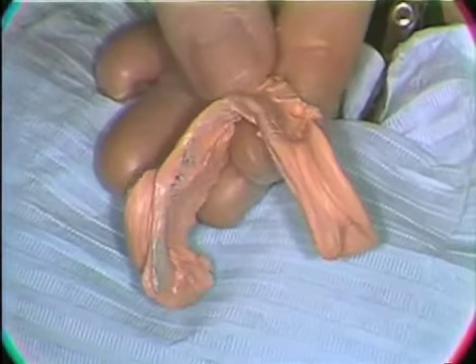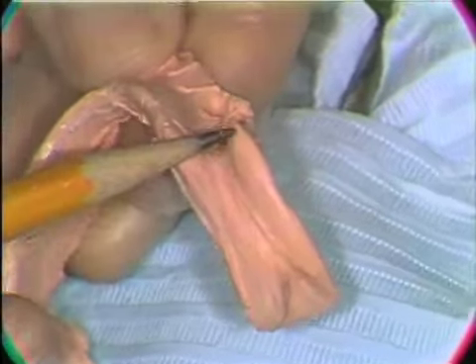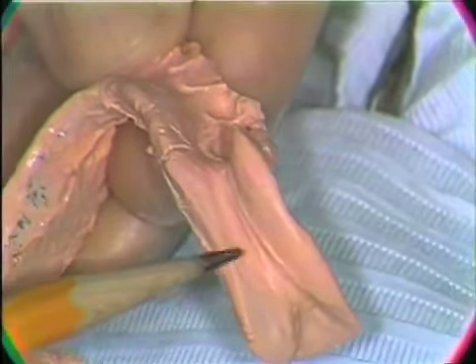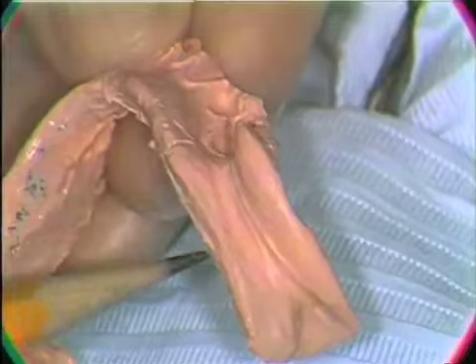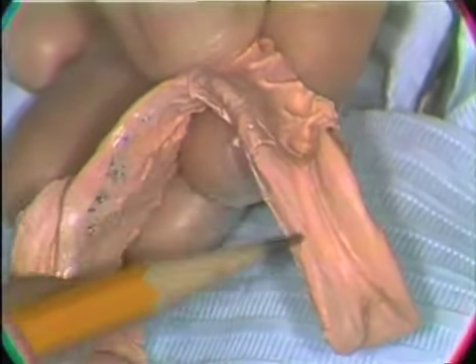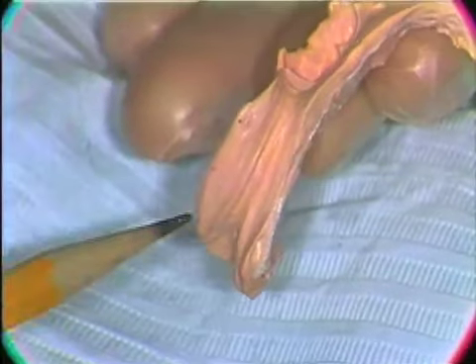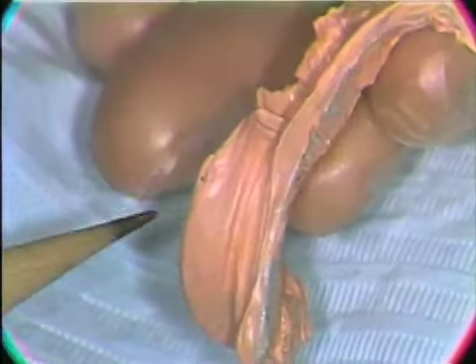Examine now the second impression, the areas that we trimmed the tray, and we find now that the peripheries are complete. We find the details of the tissue. This is a little bit overextended here. The tray is still a little bit wider than the peripheries, but yet we have a good peripheral roll all the way around the lingual area of the tray. So we have all the peripheries. We have the tissues around the teeth. We're very close on this impression.